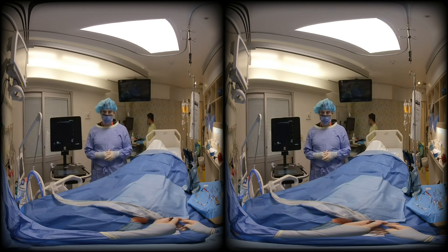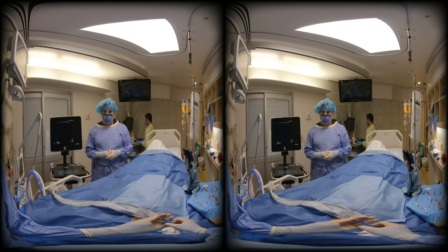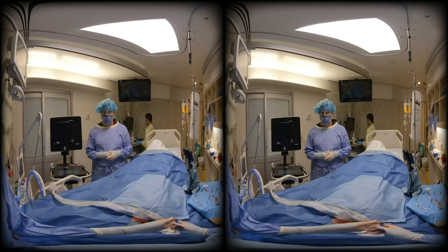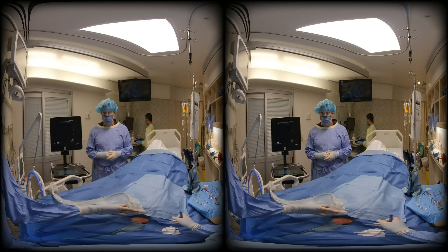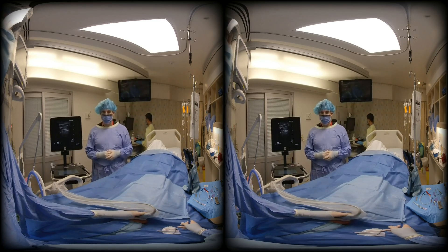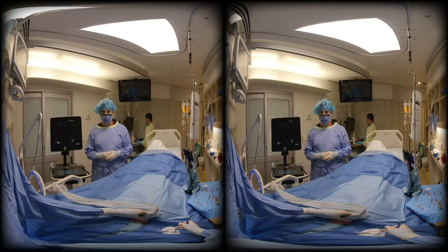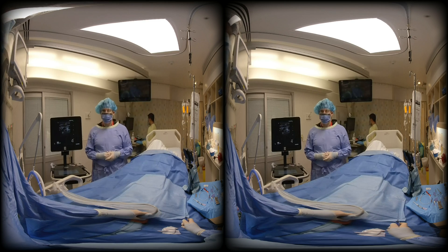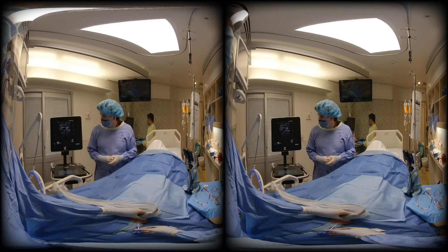Allow some time to pass for the skin to actually be properly anesthetized. Next, prepare your introducer needle. Make sure the needle and syringe are not connected tightly. Once you are satisfied, identify the IJ and place it in the middle of the screen. This will mean when your needle enters at the middle of the probe that you are well lined up.